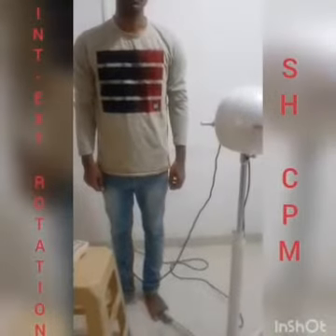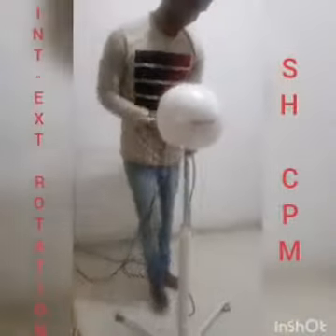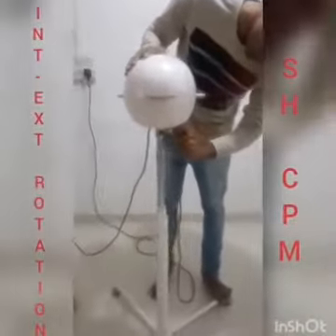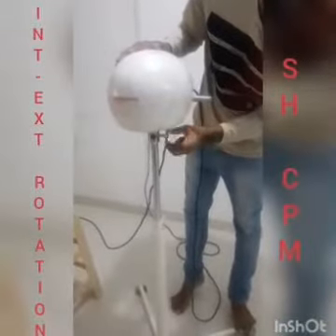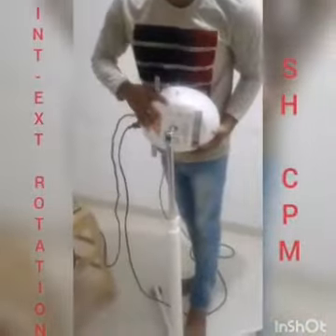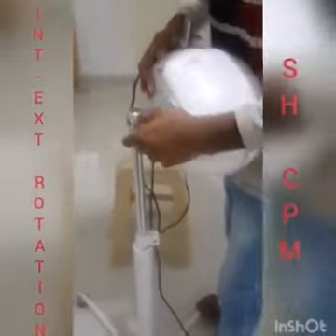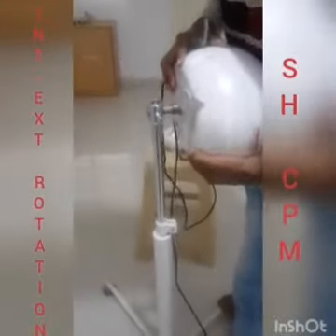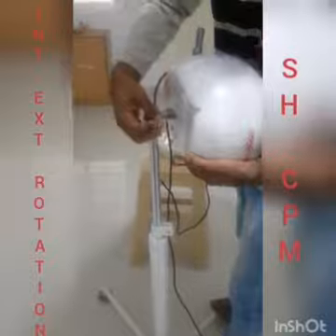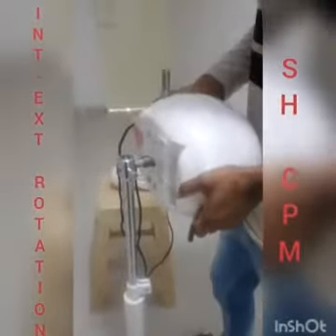For the movement of internal and external rotation, you need to change the position of the machine head. For this, loosen the screws using the Allen key. Remove the machine head and place it horizontally in this way. And then tighten the screws.